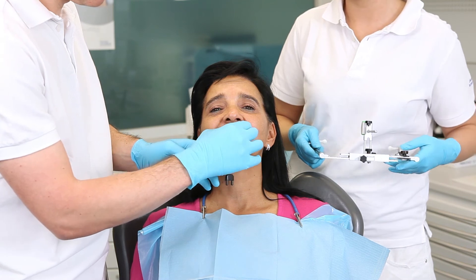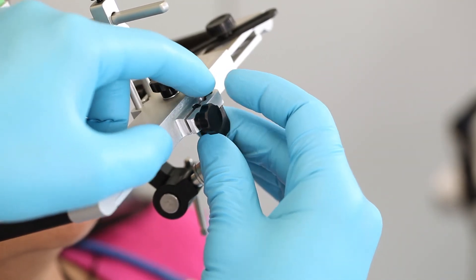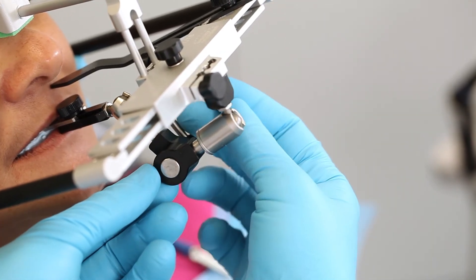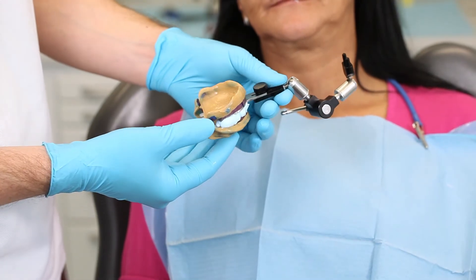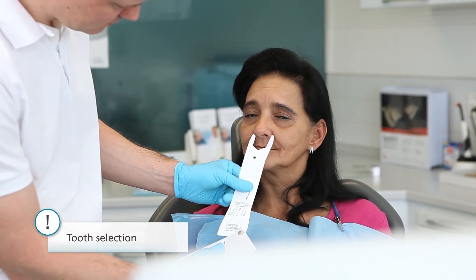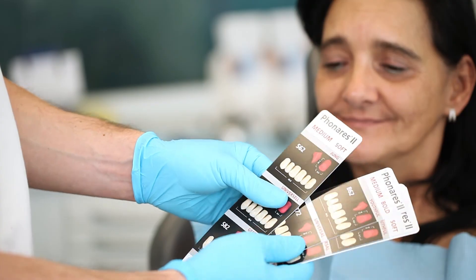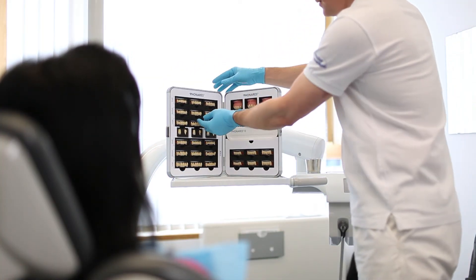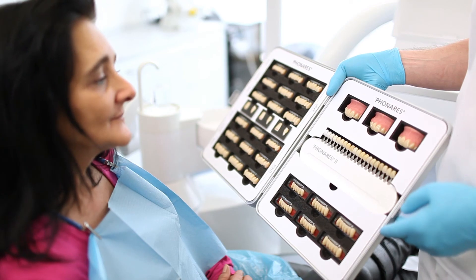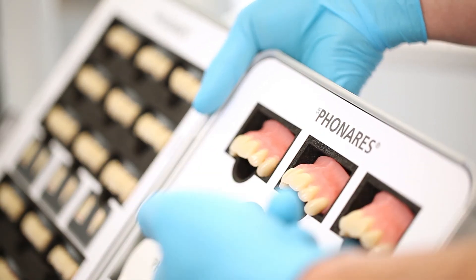Optionally, you can use the 3D universal transfer bow for skull-related model orientation. Attach it directly to the Nathometer M by means of the 3D joint. The form selector helps you to choose the appropriate teeth. The integrated facial meter is used to determine the width of the nose, providing a reference for the size of the teeth. Together with the patient, you can now select the desired tooth shape and shade. It's also important to find out from the patient if they would like the anterior teeth to have a straight, natural, or individualized position. Subsequently, send all the information you have collected to the dental laboratory.